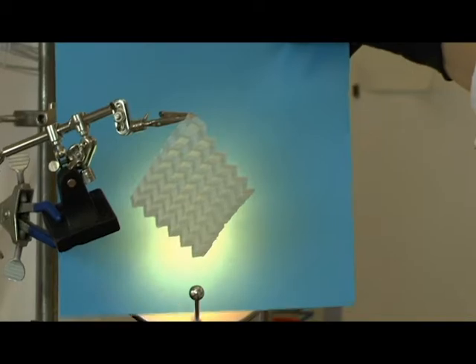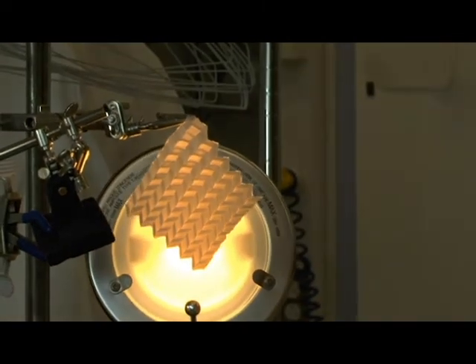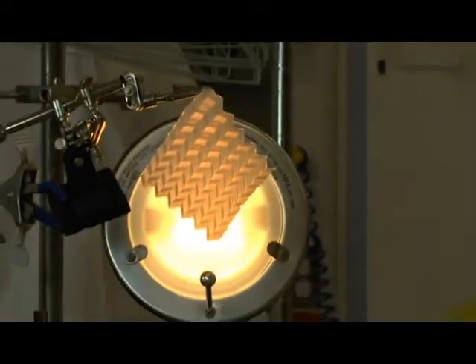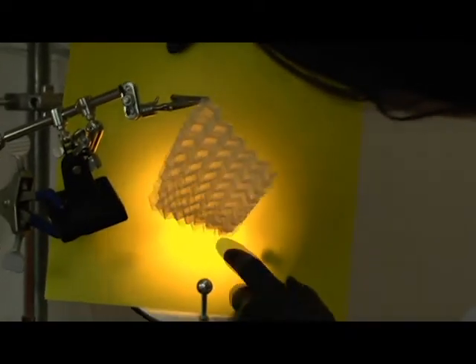We actually used origami paper to bring out the color. So we used different colors of origami paper in the background behind these implants with light shining from the back. And that gave the implants these colors, and then through different light setups we could really get interesting shadows that even in a 2D image you can get a sense of the texture and the elevation behind the implant.